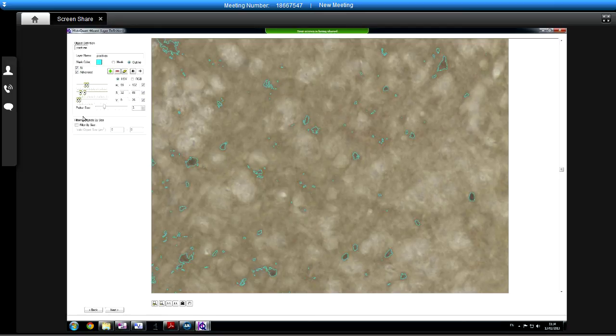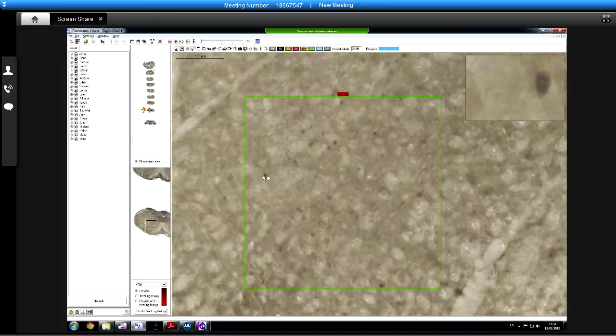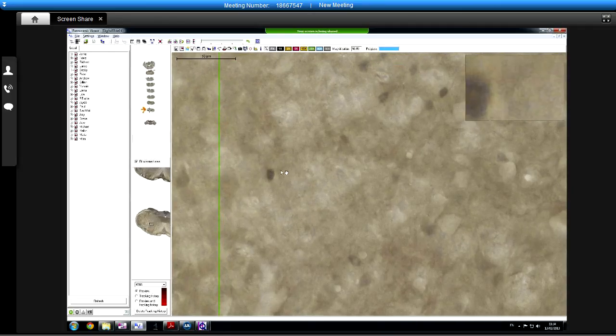Okay. So what you can do now is, it's jumping about a little bit, but if I just click on the main viewer button again, that's still running in the background. And if I just zoom in and have a look at one of these, for instance, so that's a good example of a positive, isn't it, I think? We should have done this at the beginning probably, to be honest, but if I just mark around there. Do you know about these annotation tools already?